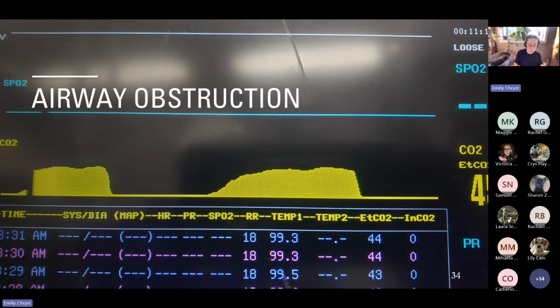You can suction this tube, but as I mentioned, intubation is pretty quick. Yes, it takes 2 people, but so does suctioning, really. It's better to just get that tube out if we've got an obstruction that's bad enough to affect the capnograph waveform. But if you start seeing waveforms like this, start getting ready for reintubation and go grab your doctor.